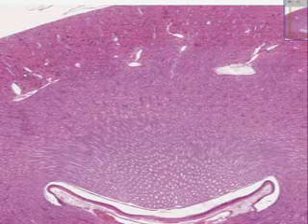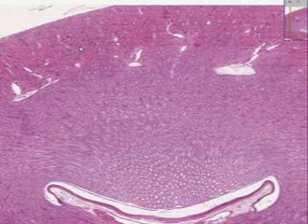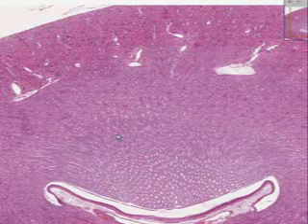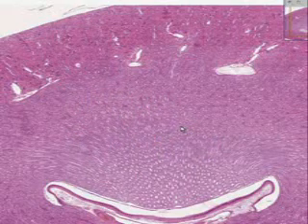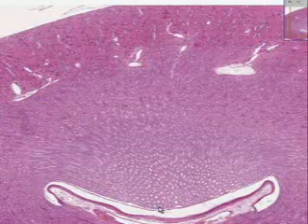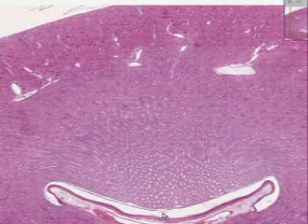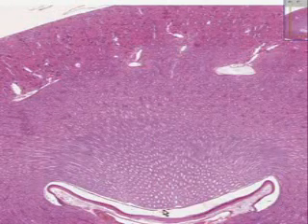Notice every kidney has an area generally towards the outside of the kidney in which you could see these little glomeruli, and this is called the cortex. Notice deeper within the kidney you have predominantly tubular structures, and this is called the medulla. Notice how the medulla is often shaped on many sections like a little triangle, and that's why this is called a renal pyramid.